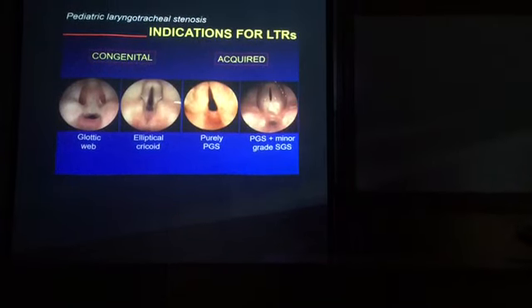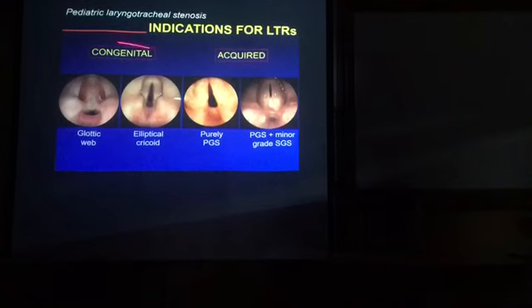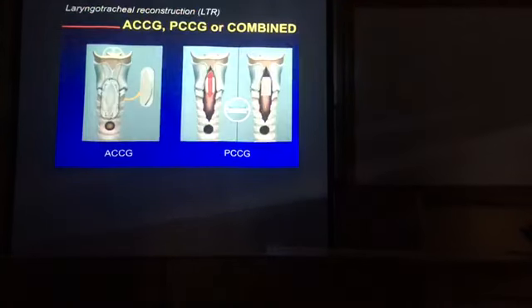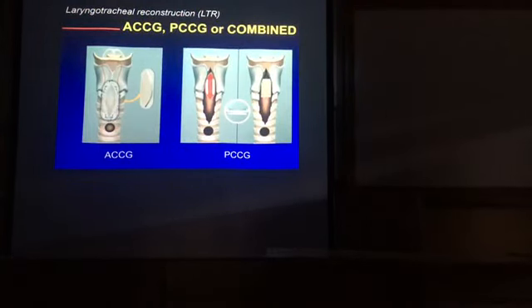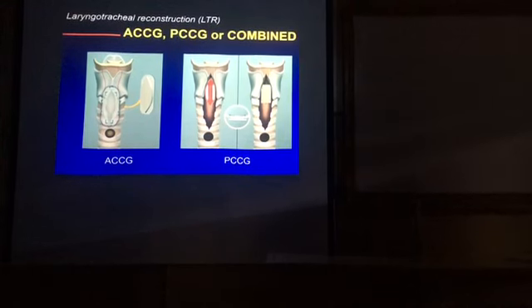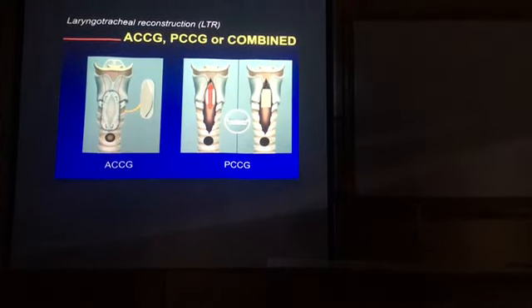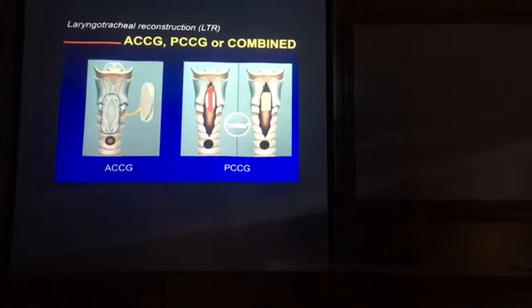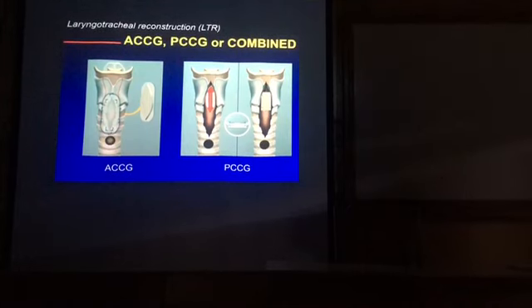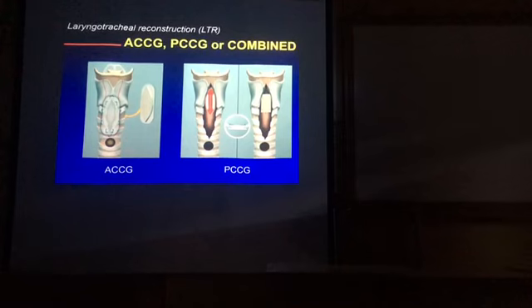This one, of course, would be with tracheostomy already because the residual airway is so small that, of course, you cannot breathe through this airway. How do you manage the airway during the surgery if they don't have a trach? If you don't have a trach, it's a good question again. So you prepare the trachea. Ventilation might be a problem for the anesthetist. So when they have a marginal airway, we usually use a laryngeal mask to ventilate them.